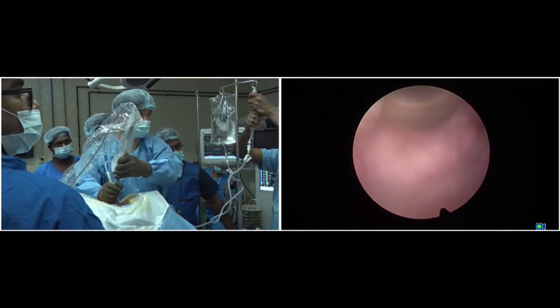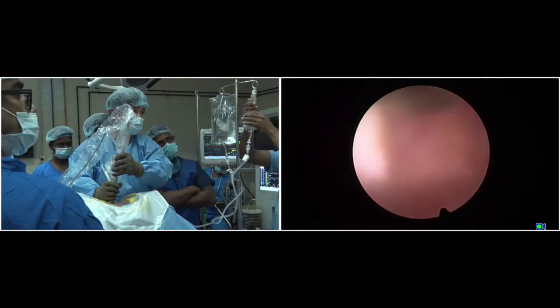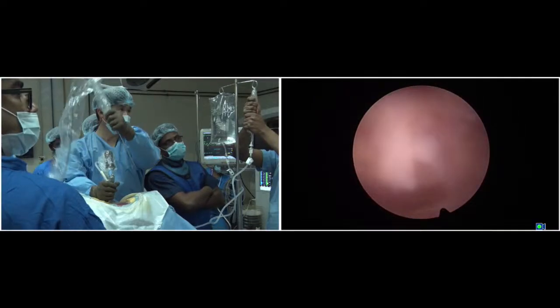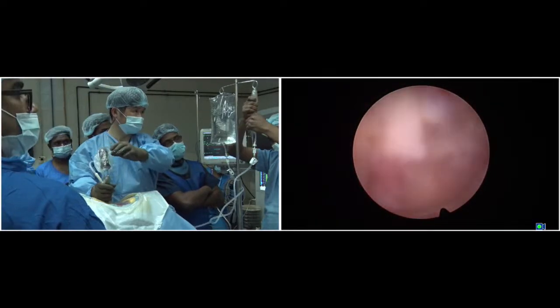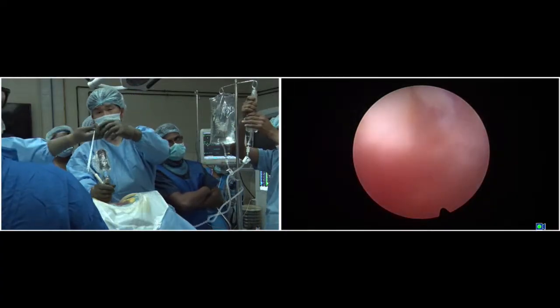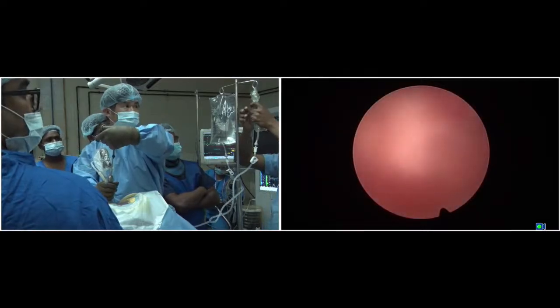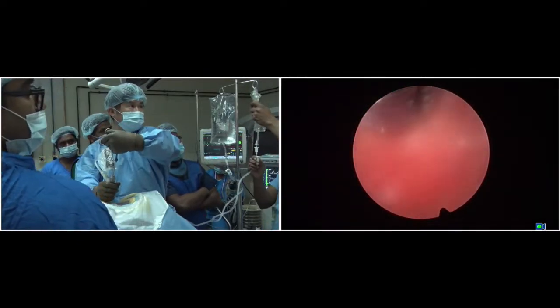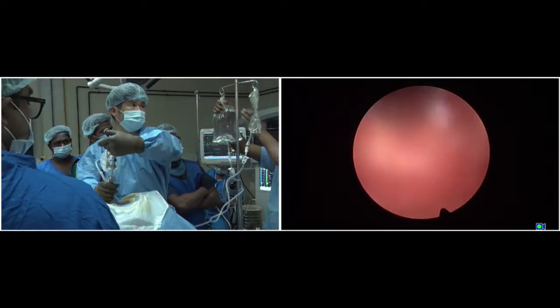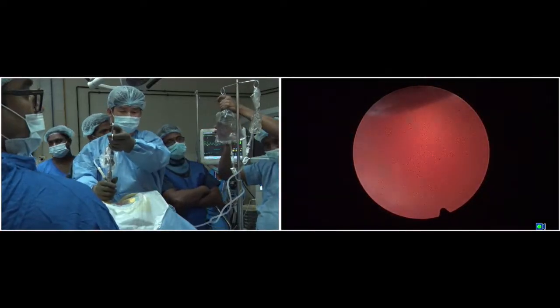I think that we are now exposed. Okay. Here is a pedicle here. Okay, I see. This fossa. There is nerve. Okay. Can you give us some small forceps? Oh, so large. Okay, it's okay.